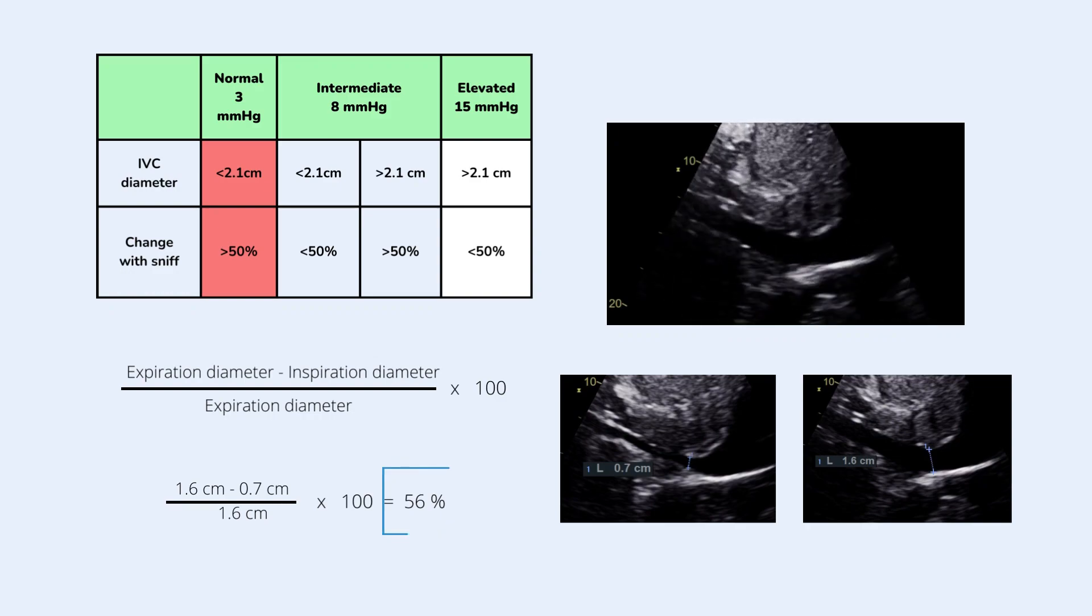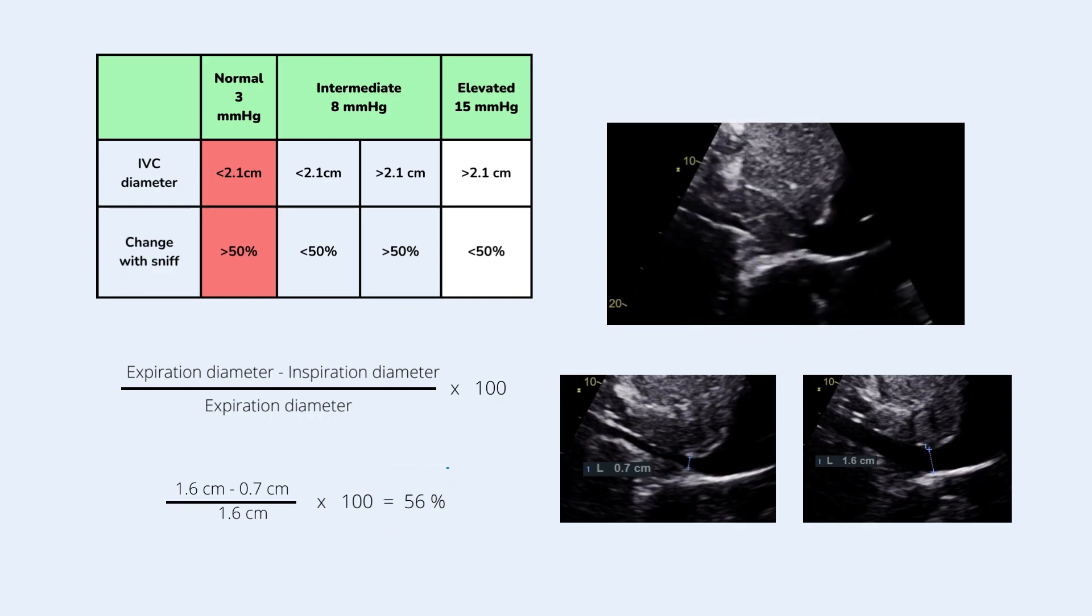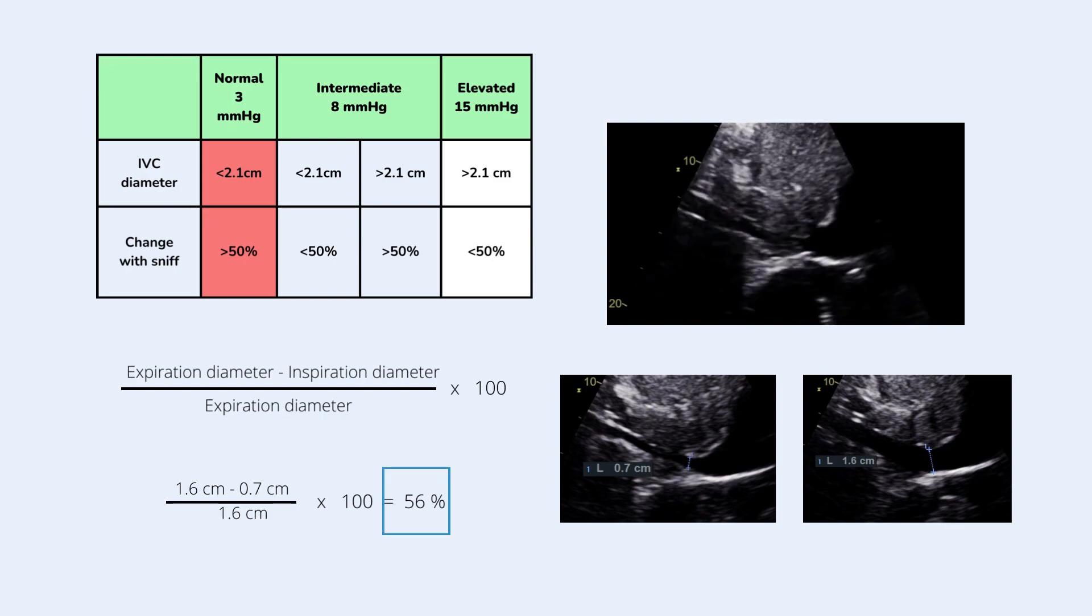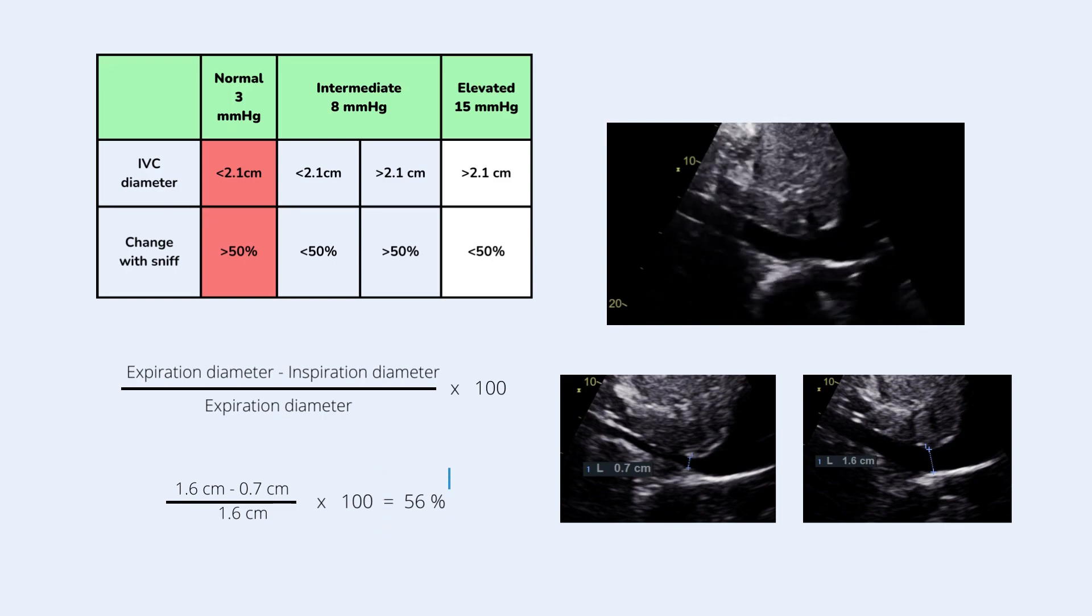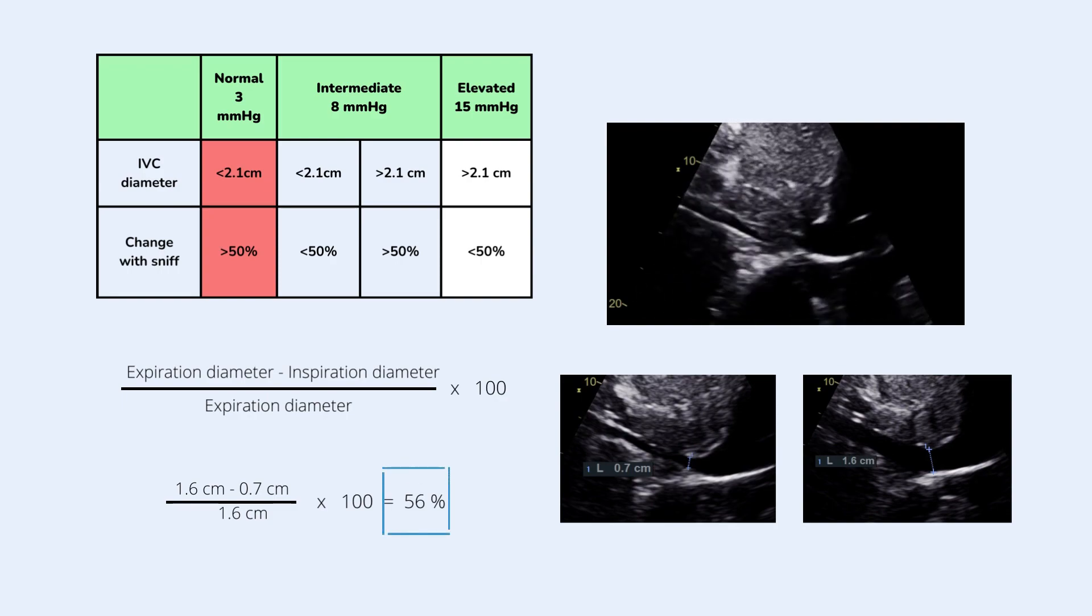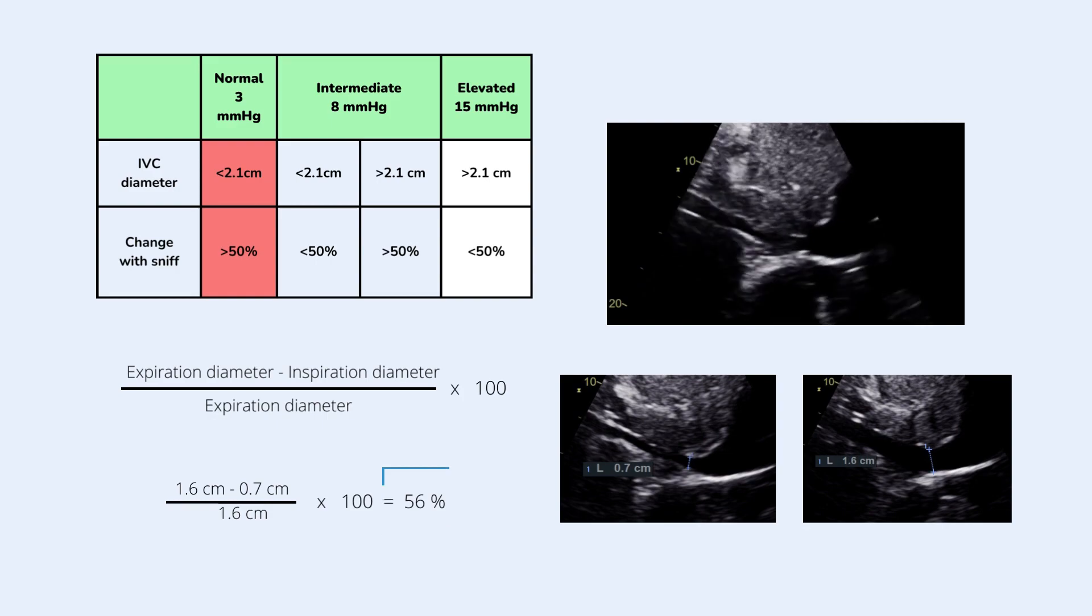A diameter of 1.6 cm at expiration and 56% inspiratory collapse during sniff will have an estimated RA pressure of 3 mmHg. Therefore this patient has a normal RA pressure.